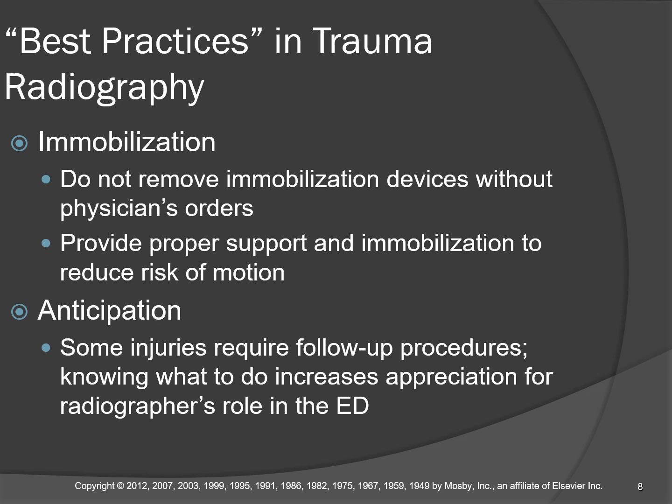Okay, that's the anticipation. You know that if you see a collapsed lung, they're going to try to reinflate it with a chest tube. And so there's no reason to leave, because you have to take an x-ray of the chest tube. You see? And so anticipate, need, and follow up. If they reduce a shoulder, yeah, you're going to have to take post-reduction views of that shoulder. Pretty simple. If they reduce fractures in the ER, you know you're going to have to take a post-reduction series.